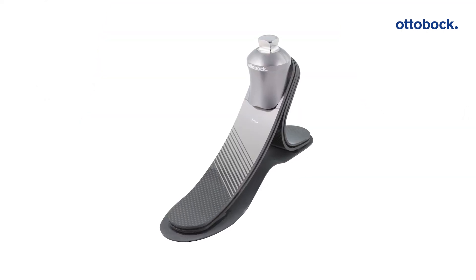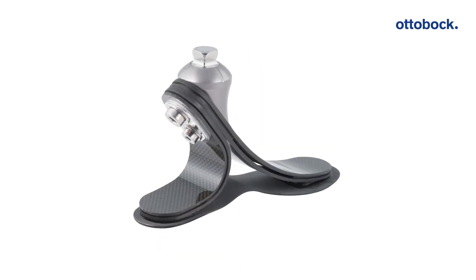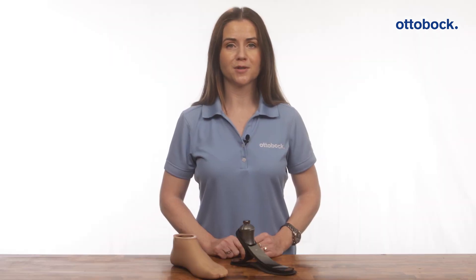The Triaz has a refreshed look with an anodized adapter and Ottobock logo, polished carbon surface on the forefoot and heel spring, and new graphics on the top surface.